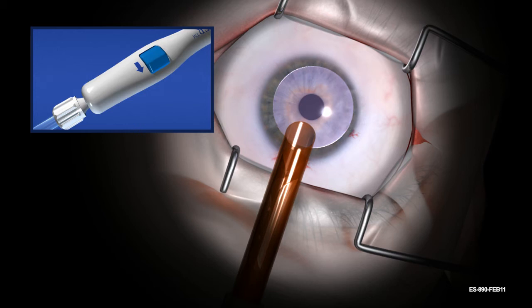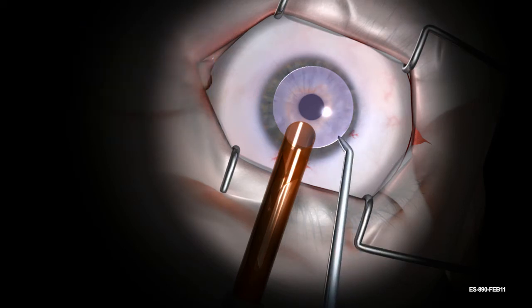Continue rotating the thumbscrew only in the direction indicated by the printed arrow until all action stops. Then rotate three full revolutions past the point where tissue is observed to be fully retracted. Remove and discard the anterior cap.